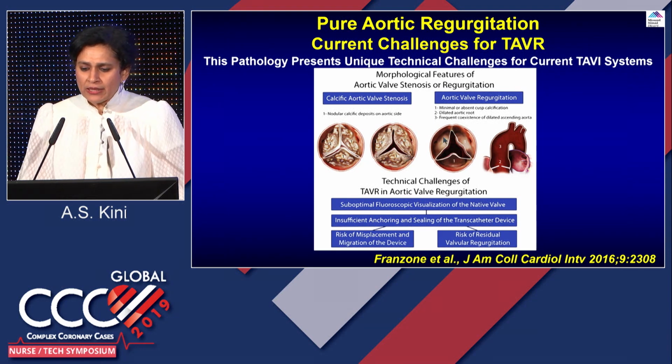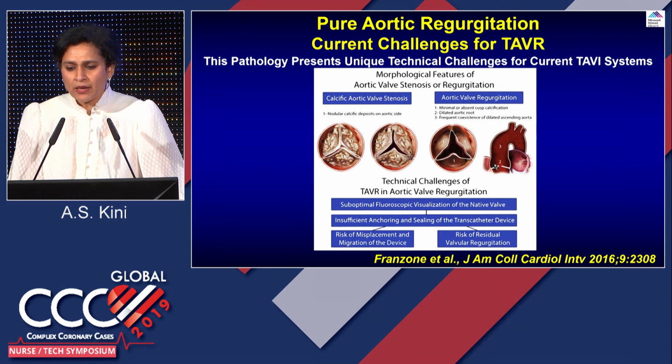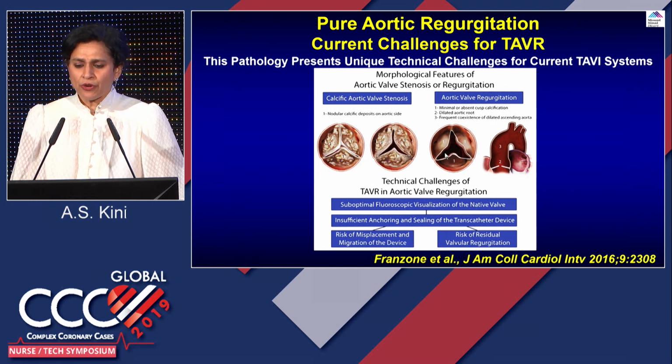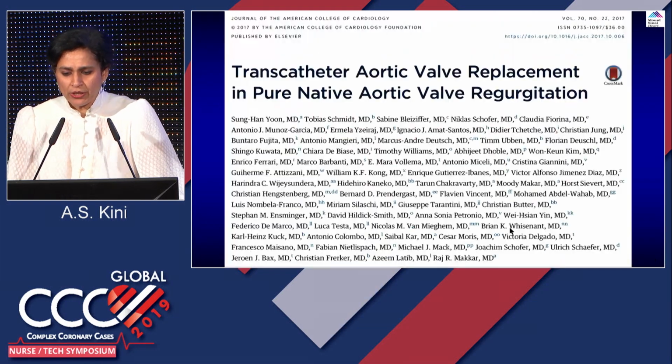If you do not have calcium, this is aortic regurgitation. There's nothing wrong in this valve itself. It is just maybe there's some dilation. The AI usually does not have any calcium. And also, they come with the aortopathy, which means there is a dilated sinus, dilated aortic root. So there's not a true anchor yet. The current valves that we are using for aortic stenosis are not meant for aortic regurgitation. So therefore, at this time, we are not placing it for pure aortic regurgitation.